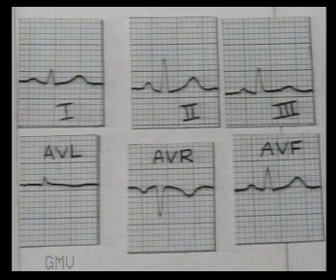A Q wave deeper than 1 mm or wider than 1 mm or more than 1/3 of the R wave is considered as significant.